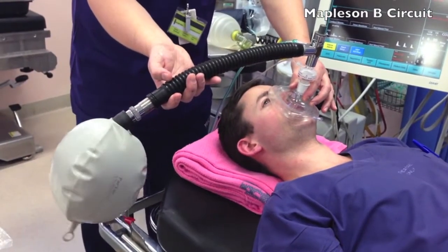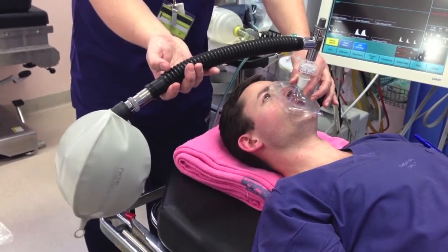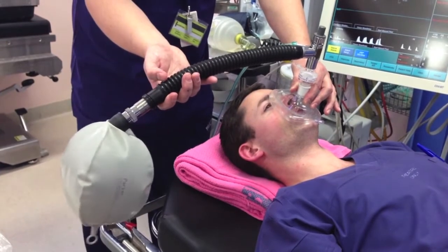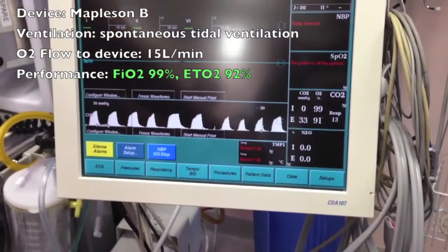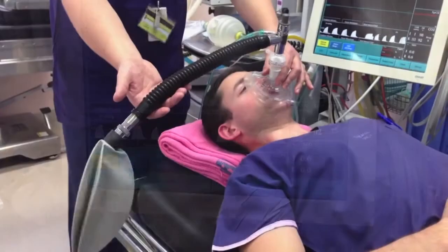Another common resuscitation device, the Mapleson B circuit, is demonstrated next. The Mapleson B lacks the separate inspiratory and expiratory ports of the bag valve mask, and inspired gas is instead exhaled into the device, relying on an adequate fresh gas flow to flush it out via the pressure relief valve. The Mapleson B is able to deliver inspired oxygen concentrations greater than 95% during spontaneous ventilation.